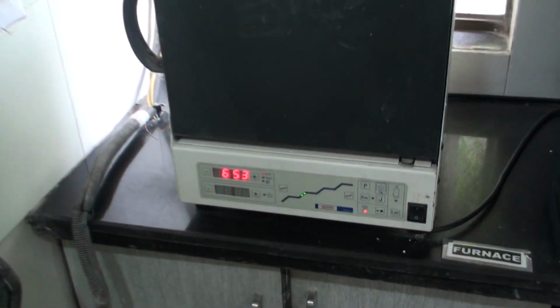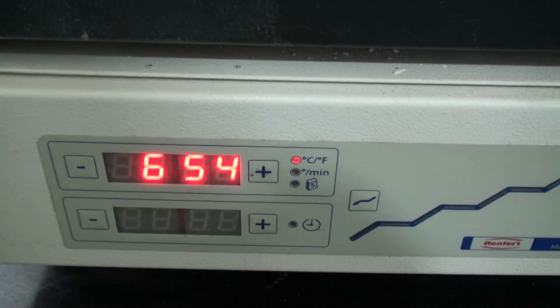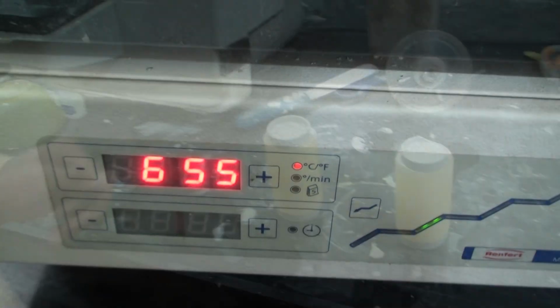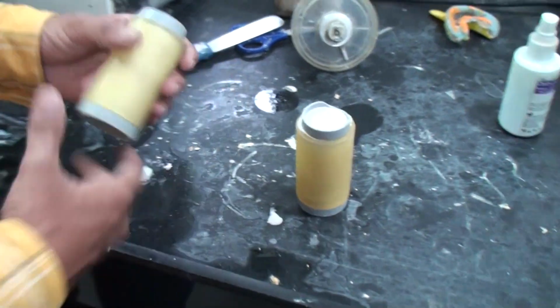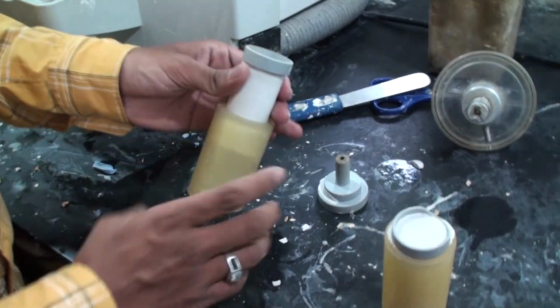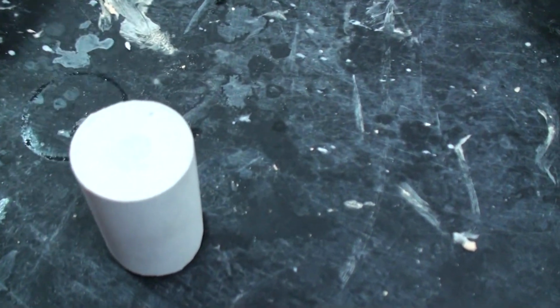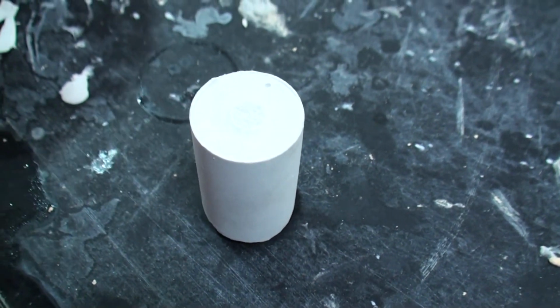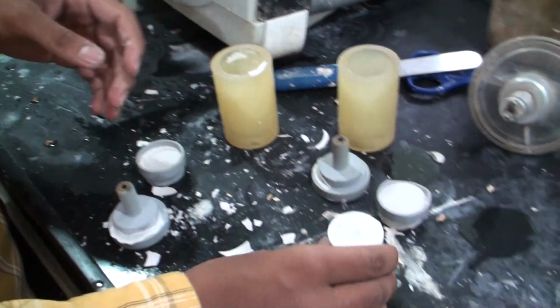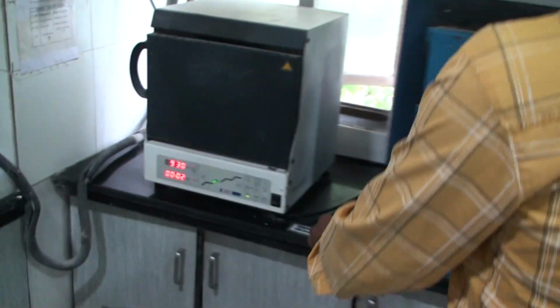And we basically wait for the whole thing to set. Now, while the thing is setting, we preheat our furnace, get it up and running, and I think it needs to reach a temperature of about 900 plus degrees. Here's our investment material all ready. Gets pushed out of the ring. The lids are also taken off. That's our ring ready to go into the furnace now. And remember, the furnace is preheated, and you take these rings into the furnace.